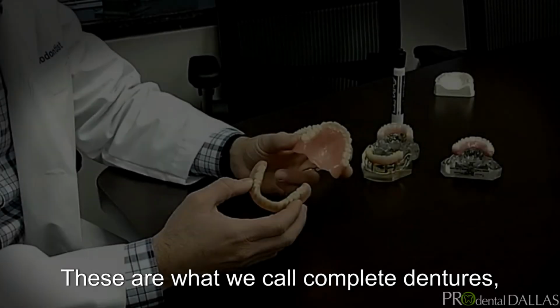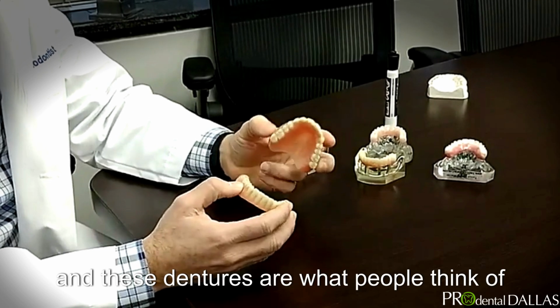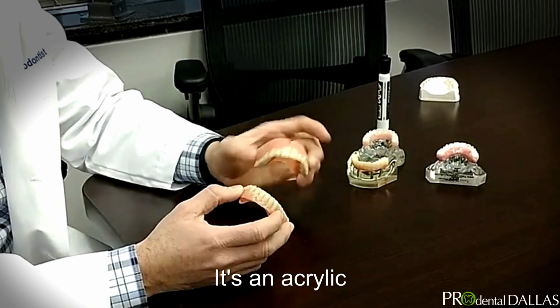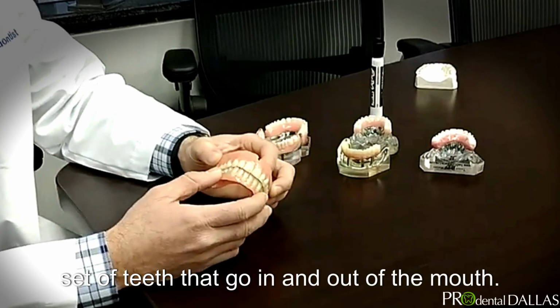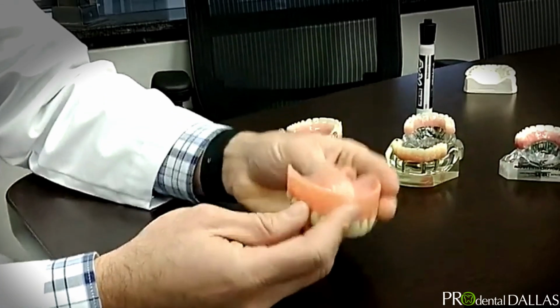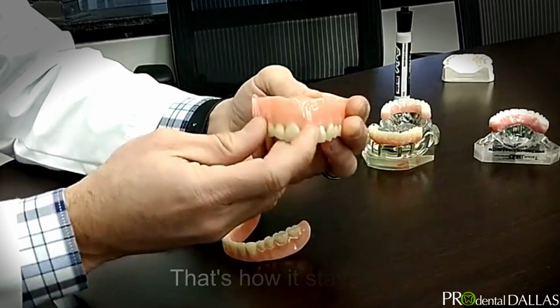These are what we call complete dentures. And these dentures are what people think of when they hear the term dentures. It's an acrylic set of teeth that go in and out of the mouth. The maxillary denture, or the top one, suctions against the roof of the mouth. That's how it stays in.